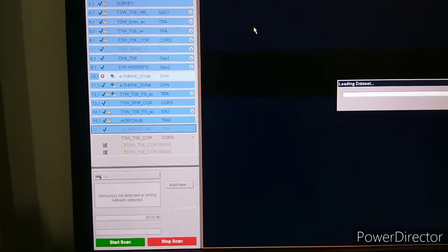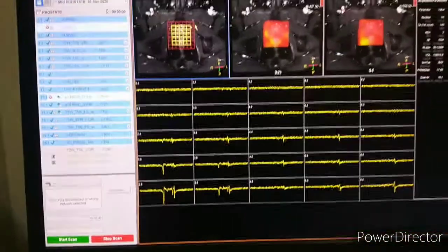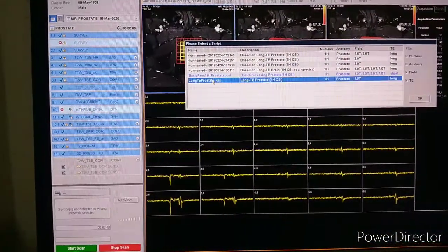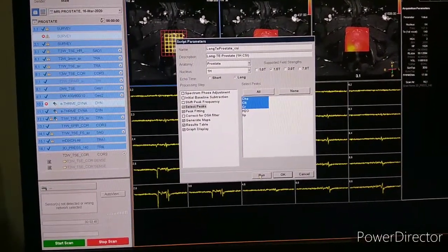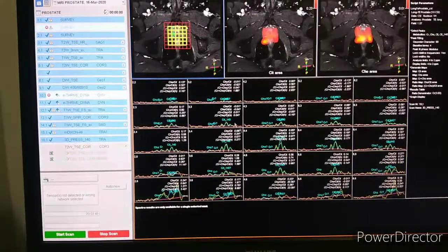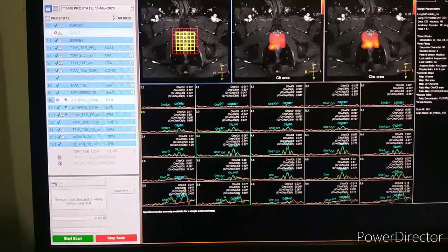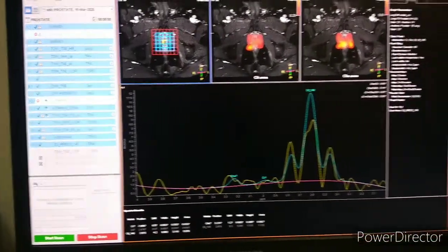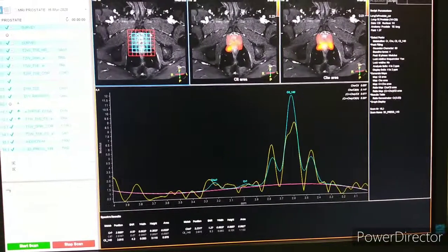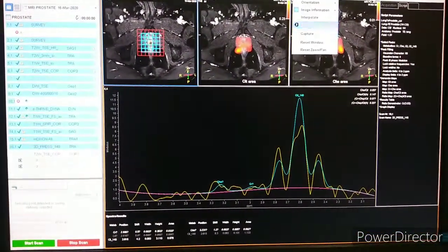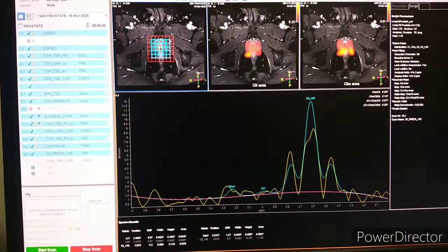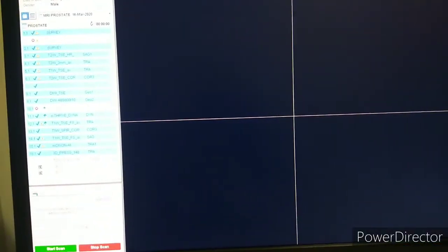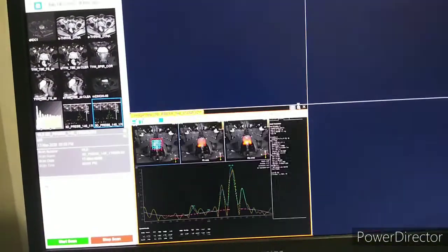We select spectrum view and select the prostate region, choosing long TE. You have to avoid the H2O water peak, then run the processing. You can select individual voxels according to your region of interest and save it by capturing. This will then come to your patient database and you can view it.